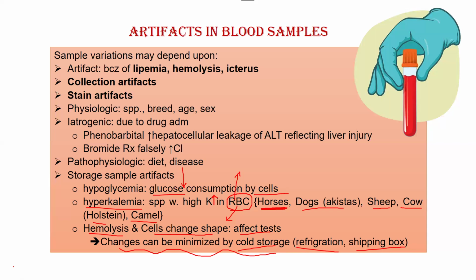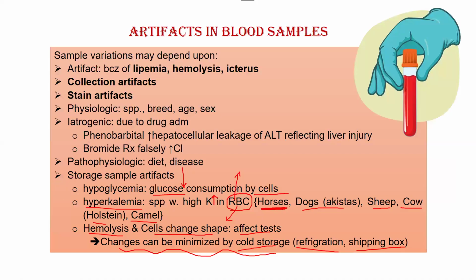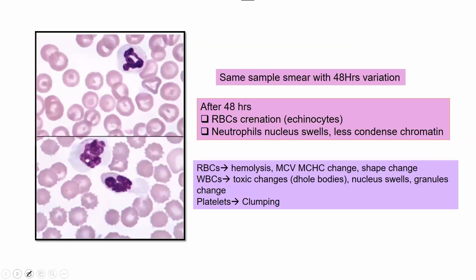This should be done. Next, in the next slide, we are going to see again a storage sample artifact. Up till now, these three things were related to storage sample artifacts related to the biochemistry panel. But this is a storage sample artifact in hematology.